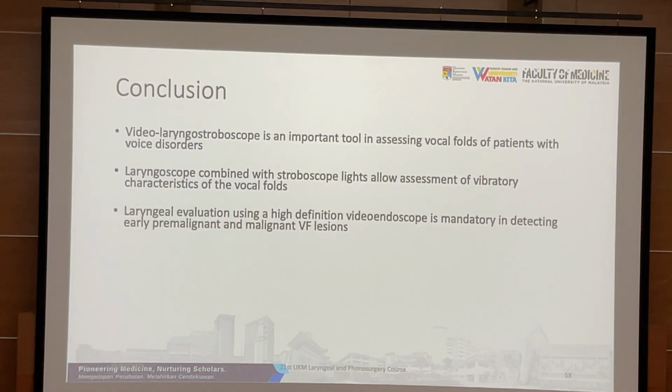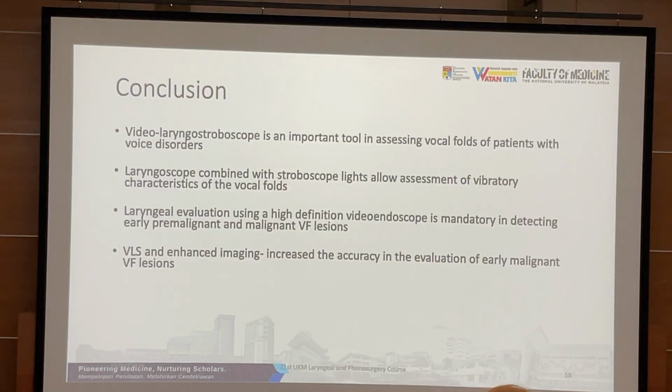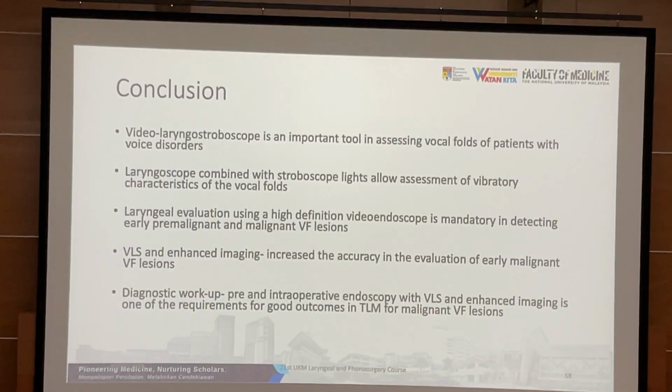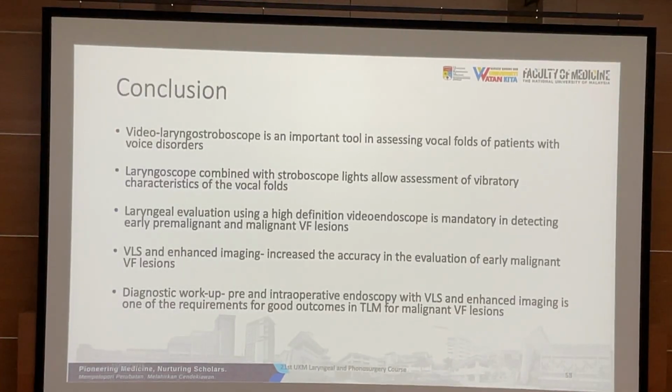So this is video stroboscope. And it is mandatory for you to use stroboscope in patients with voice disorder, and it is also a useful tool for you to differentiate between pre-malignant, malignant and benign lesions, especially when you combine it with enhanced imaging. And in this case, if you use Pentax, it's called iScan. If it's Olympus, it is narrowband imaging, and there are other names for other companies or instruments.